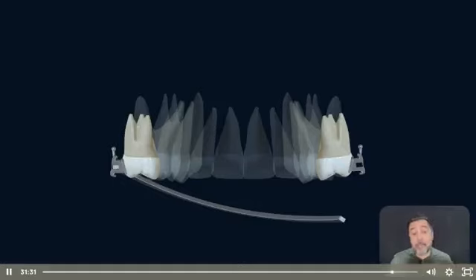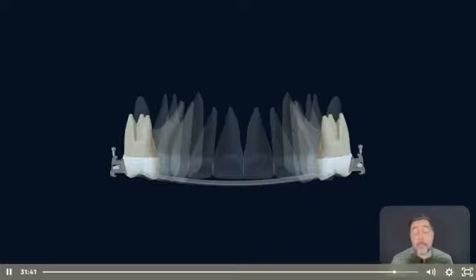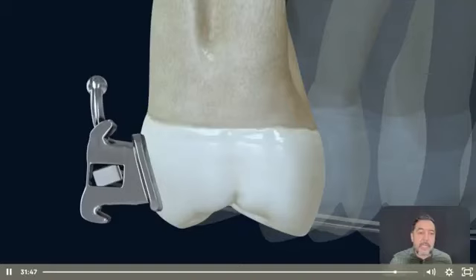We apply to that side, to this side here, we are applying a negative crown torque. Why is that? Because when I insert in the other tip, in the other tube, the other side of the wire, we are applying a couple that is generating two forces.